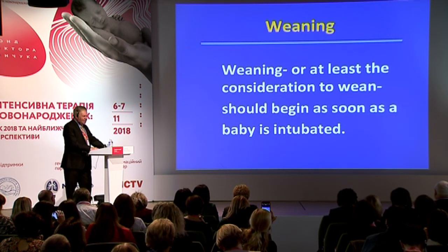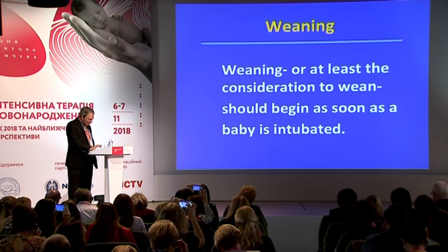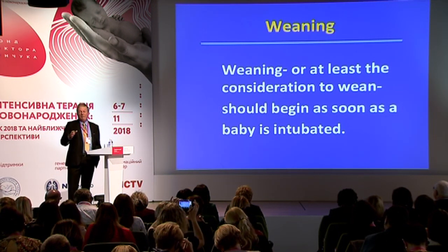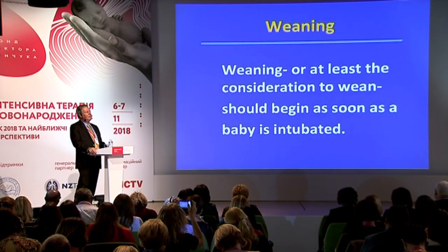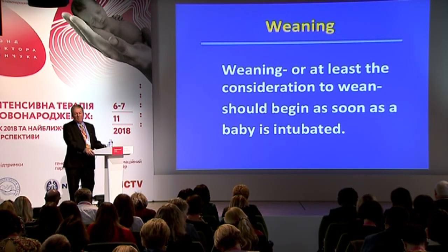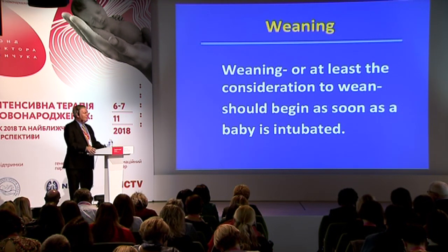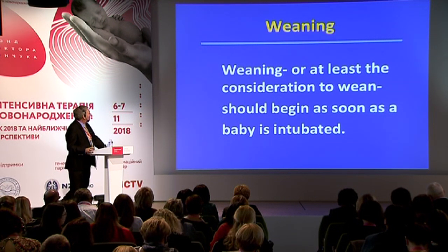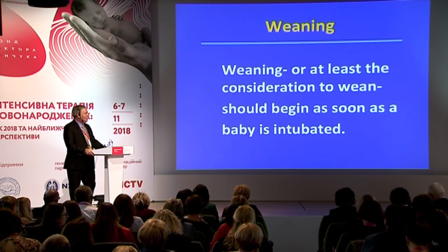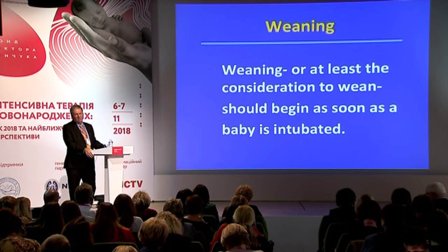There's an old saying, I don't know if you use it here in Ukraine, but we use it at home a lot. We say that discharge planning from the NICU, from the neonatal intensive care unit, begins at admission. And I think there's a parallel for mechanical ventilation, and that is weaning, or at least the consideration to wean, should begin as soon as a baby is intubated.